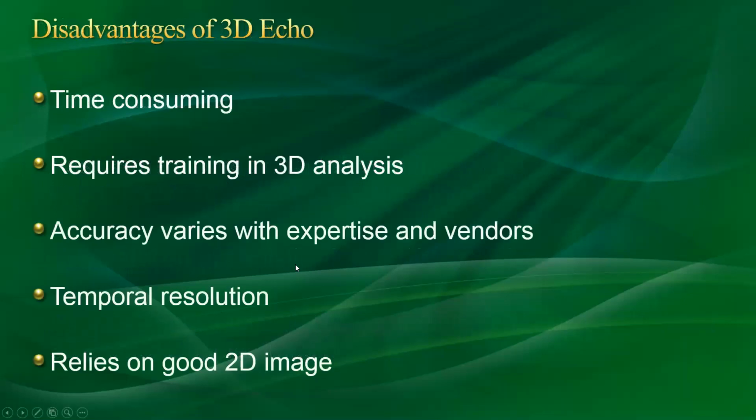What's the disadvantage of 3D echo? It's time consuming. It takes a lot of time. I spent a lot of hours doing that. It requires training in 3D analysis. Different vendors have different techniques and processing knowledge, and you need to learn those. The accuracy varies with expertise and vendor. Sometimes different experts, when they look at the data set, crop it differently and give you a different result.